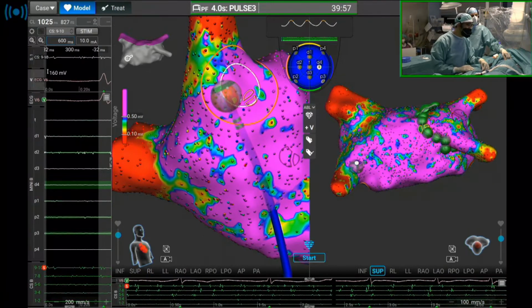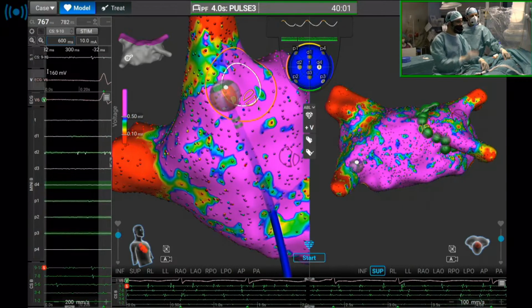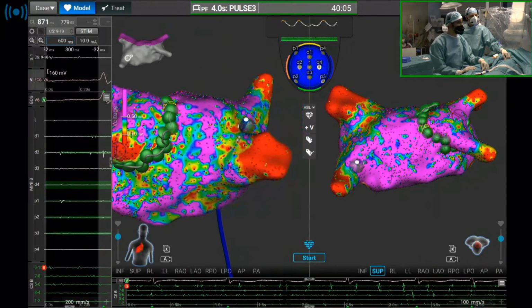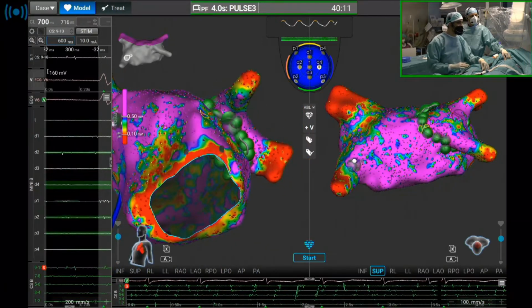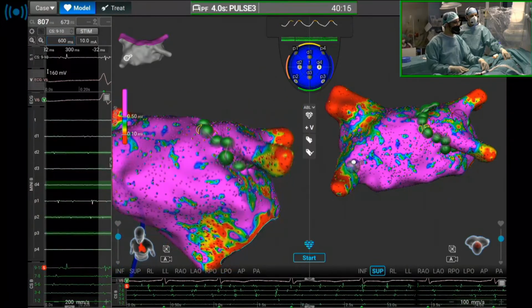We started by isolating the left veins. Wojtek, can you show a little bit the left veins? The green tags are tags for pulse field ablation, and we did the left side completely with pulse field.